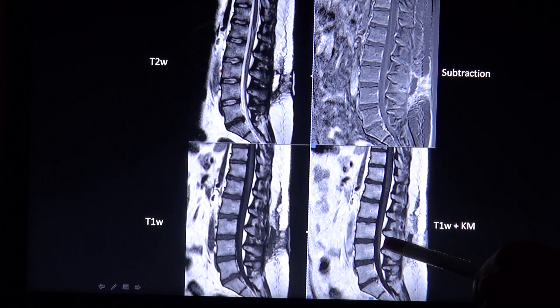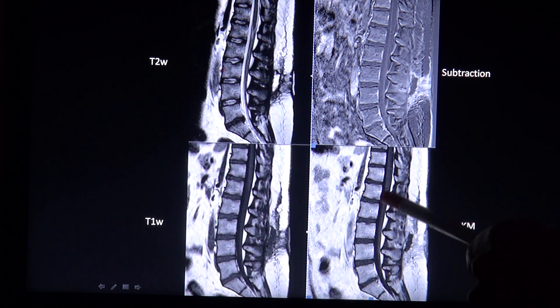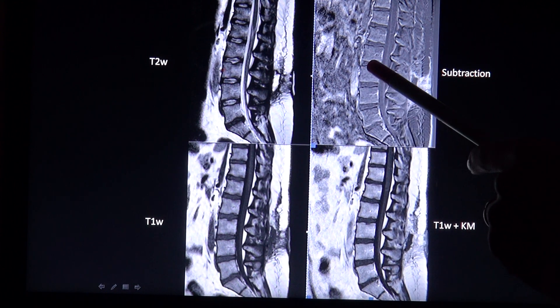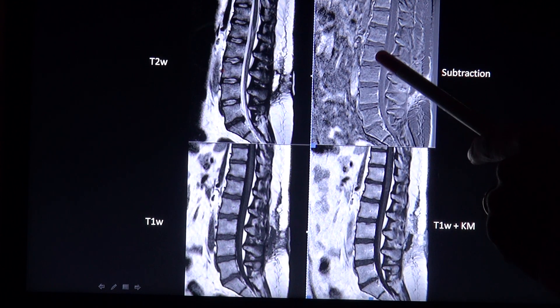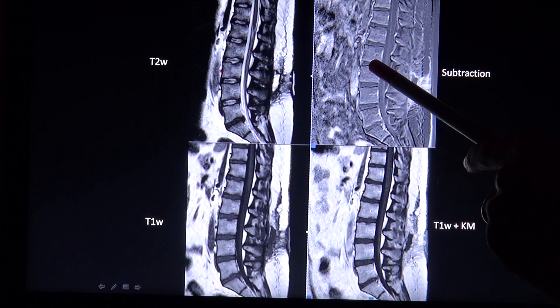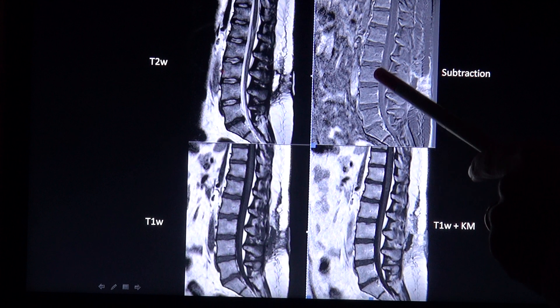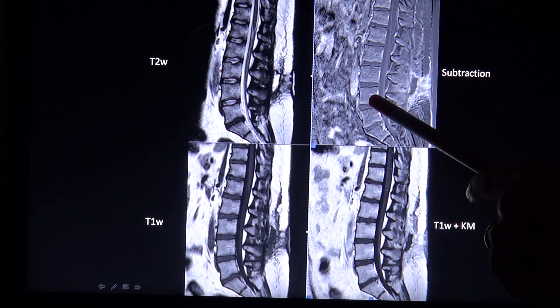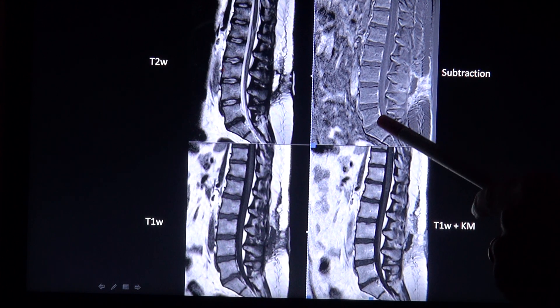You can see enhancing structures like vessels even better in the subtraction image — for example, dorsal to the bone, there is a venous plexus.